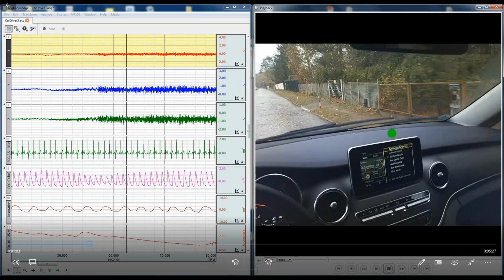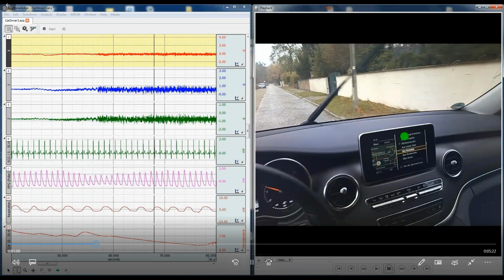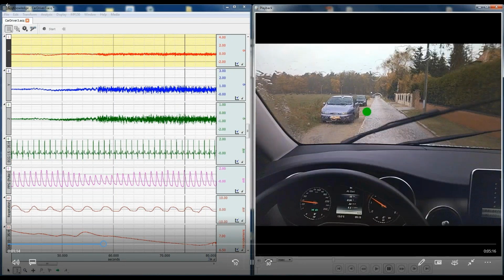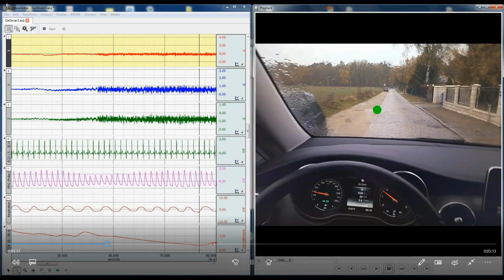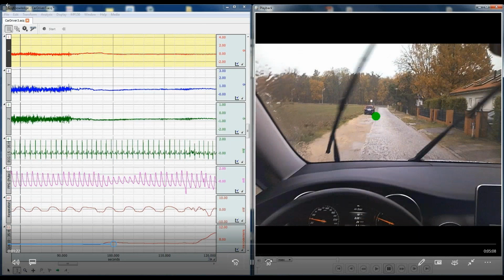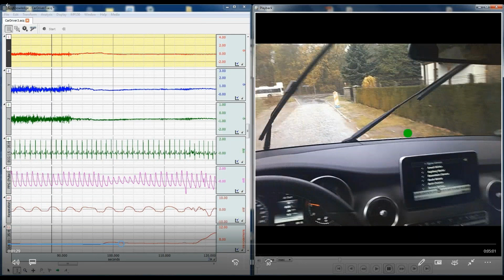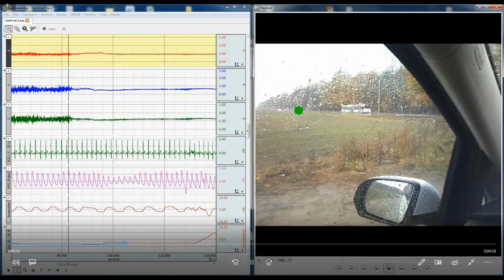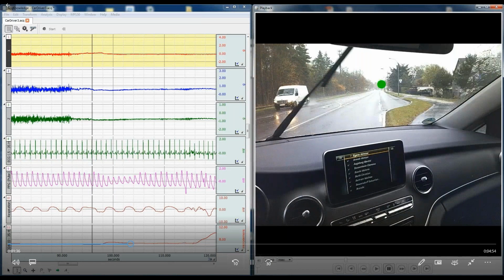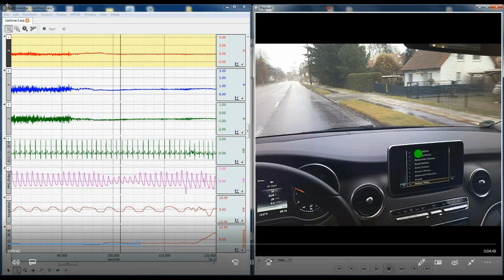So the accelerometer is another really useful tool for synchronizing the logged physiological data with eye tracking. And this is the perfect demonstration. Someone driving a car, the physiological signals are coming off. We're actually looking at ECG, respiration, pulse, and electrodermal activity. And you'll see we're just approaching an intersection here, and the transition in the road occurs again. And now we're turning onto a much smoother stretch of road, and that just gives you a good idea of how easy it is to synchronize these things.